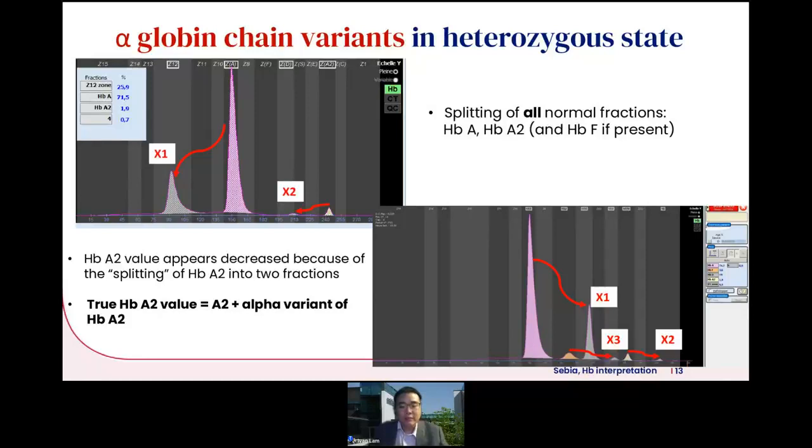So these are the actual capillary electrophoretic profiles of alpha globin chain variants. You will see a distinctive splitting of all hemoglobin peaks. Another important point about this splitting is, if you would notice by now, that the splitting actually happens in an equidistance on the x-axis. So all the alpha variant globin peaks that are being formed shift in equidistance. You can attribute this to the same chemical change that's being done to every hemoglobin. Therefore, the splitting and the shifting is equidistant.